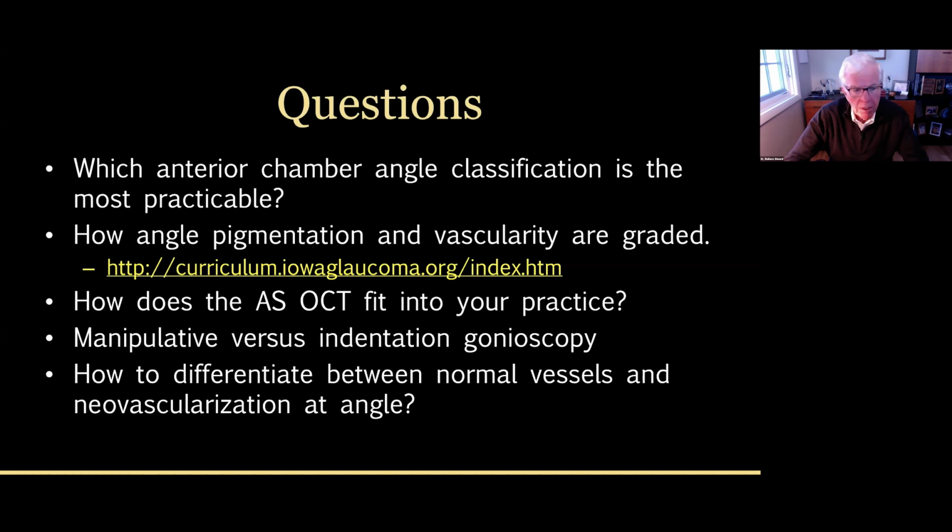How does anterior segment OCT fit in my practice? I don't really use it very much. I use anterior segment ultrasound biomicroscopy more often because that lets me look beneath the iris. The OCT doesn't show me much that I can't see with my gonio lens.